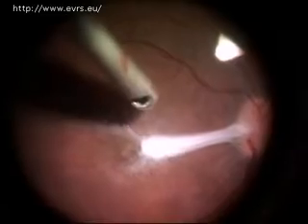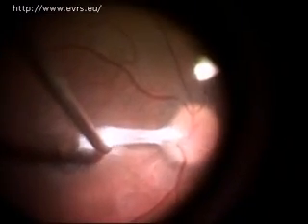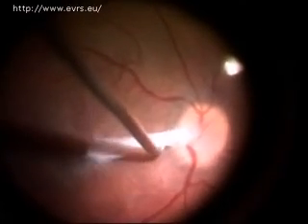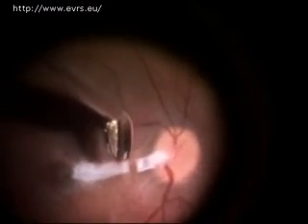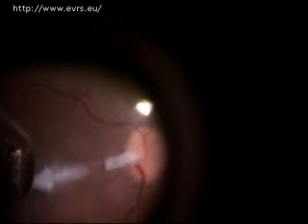Our final patient was presented for treatment after resolution of blood from the vitreous following severe head trauma. Epiretinal membrane, as a remnant of blood coming from the optic disc into the preretinal space, was diagnosed. During vitrectomy, the epiretinal membrane was partially cut away.